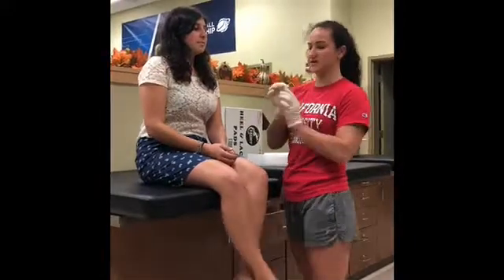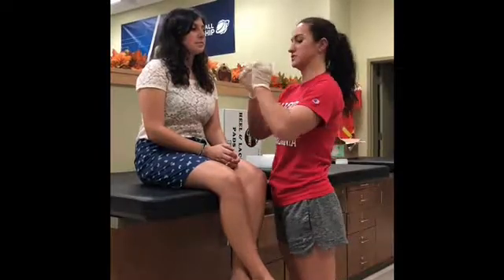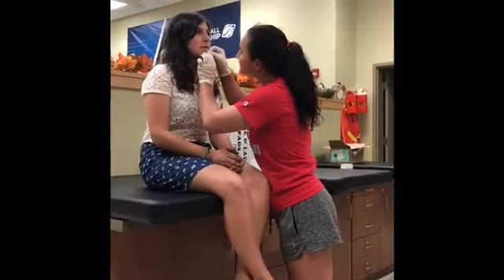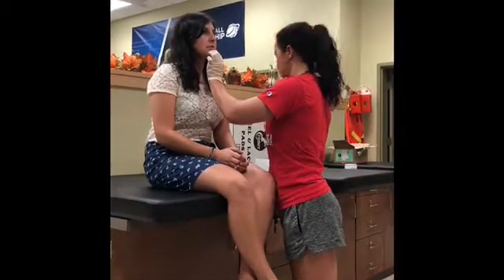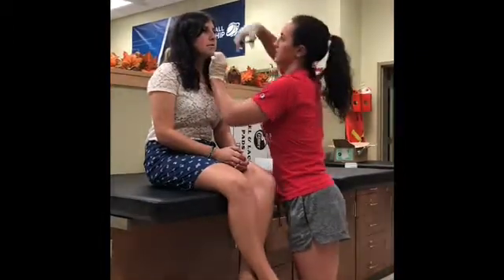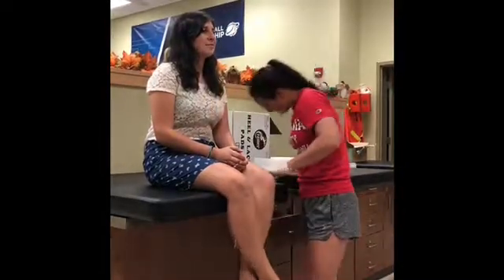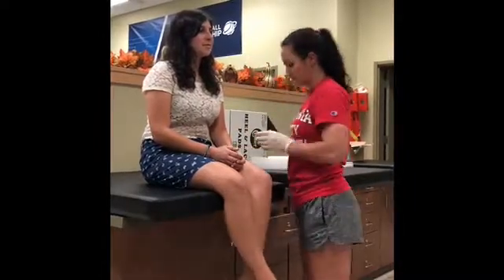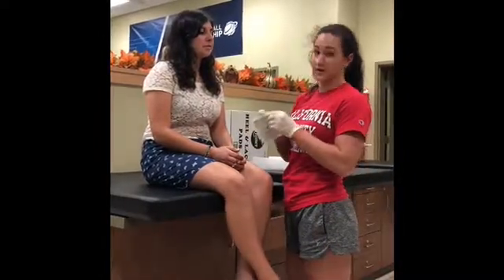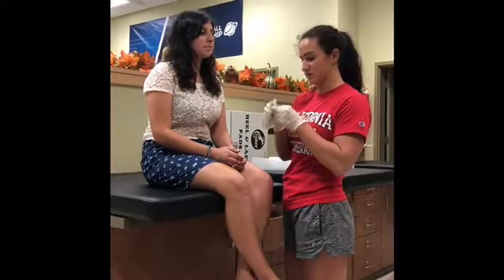Same as before, but you're going to pull in the opposite direction just so you can close the wound as much as you can. I'm applying a non-adherent pad so we can make sure the steri-strips stay on as she goes to the hospital.